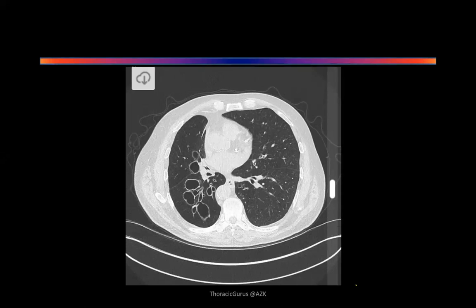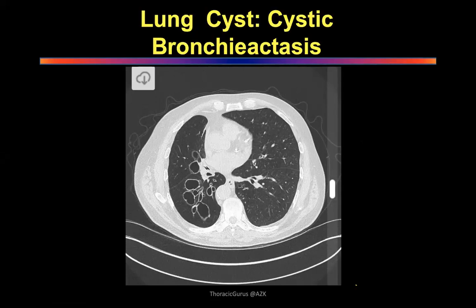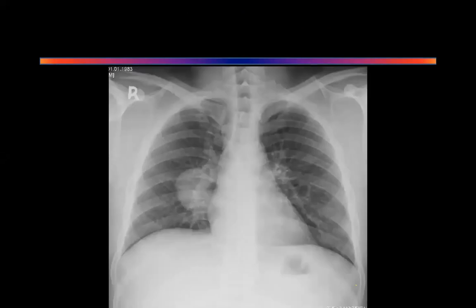I would not go into congenital bronchiectasis and things like that, unless and until you know the features, that's different. But in a standard clinical examination, if I saw this, I would say this is more likely to be bronchiectasis. I'd like a good clinical history, and I would like to examine the patient before I would say anything. I would also like to see the chest x-ray of this patient. Simple, nothing complicated. This is cystic bronchiectasis, as simple as that. Make sense? Just stay simple. I'm teaching you to stay simple.